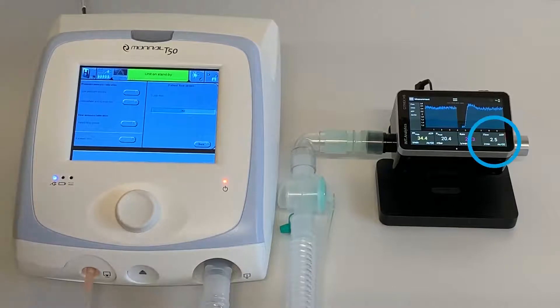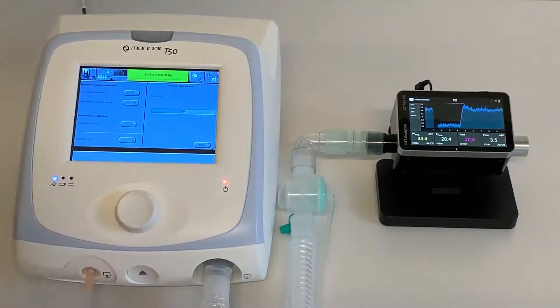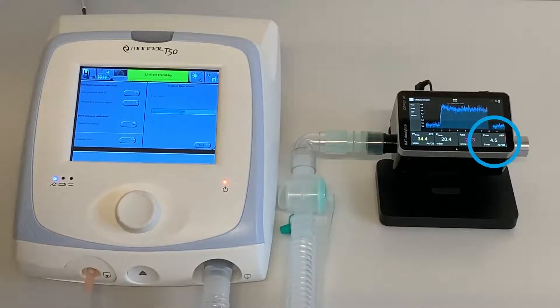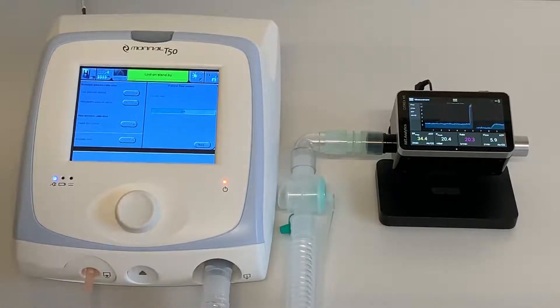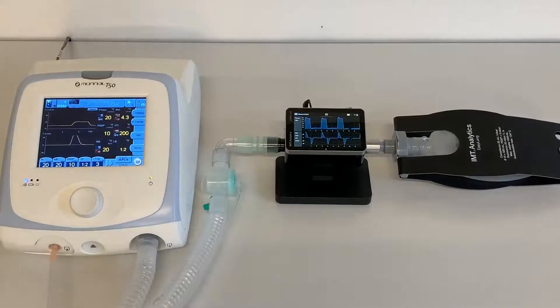Verify the T50 is delivering a flow of 3 liters per minute on Citrex and press the control knob to confirm. Then verify the T50 is delivering a flow of 10 liters per minute on Citrex and press the control knob to confirm. Continue according to the screen information until all parameters are verified and the test is successfully completed.